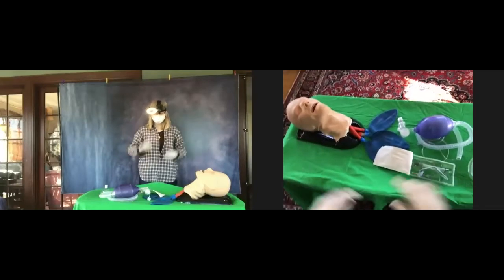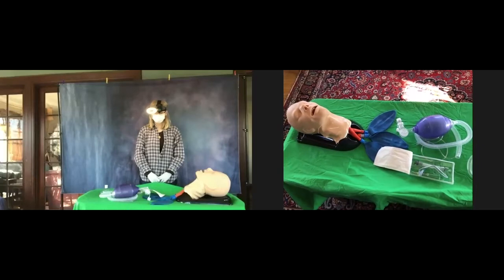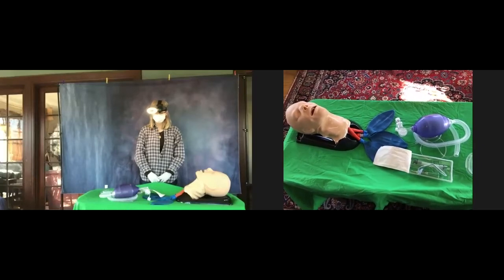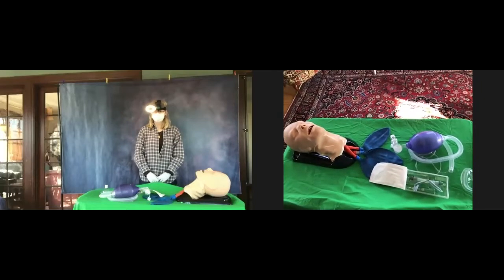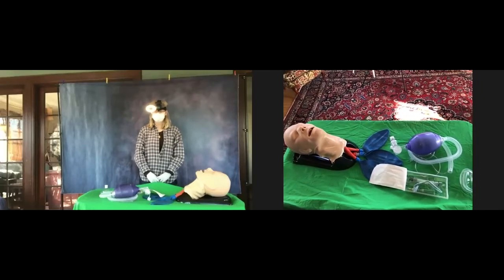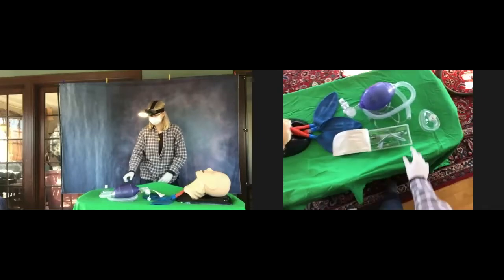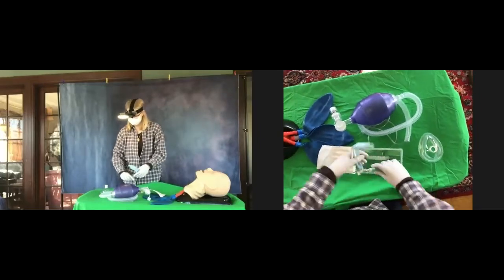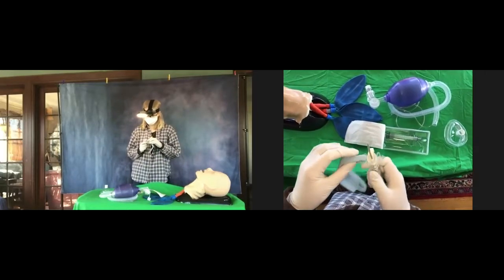All right, so I'm going to walk you through doing an emergency surgical airway using the QuickTrach. What I want you to do is take the whole QuickTrach unit out and disconnect the strap from the QuickTrach.